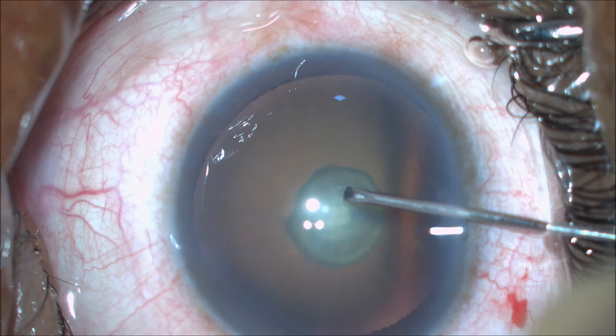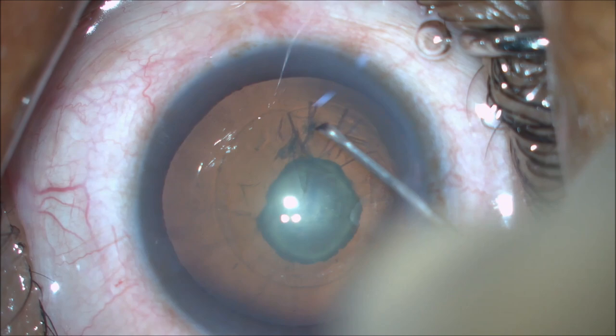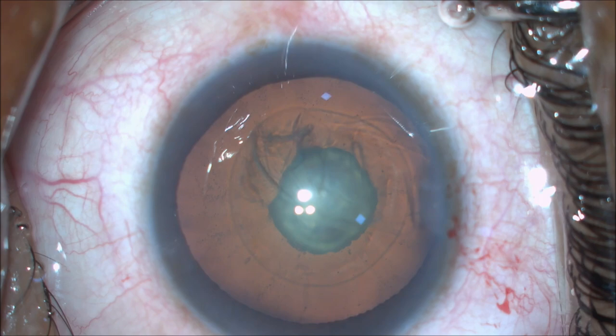Ideally, we aim for a size of 4.5 to 5.5 mm. In this case of posterior polar cataract, REXIS is important as in the case of posterior capsular rent, optic capture can be done.